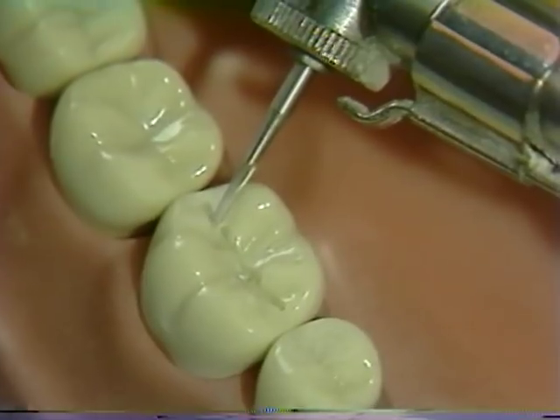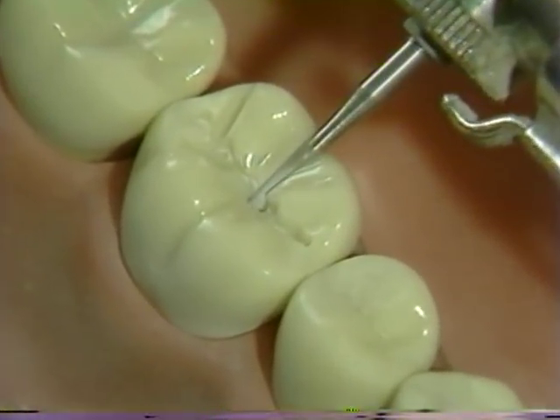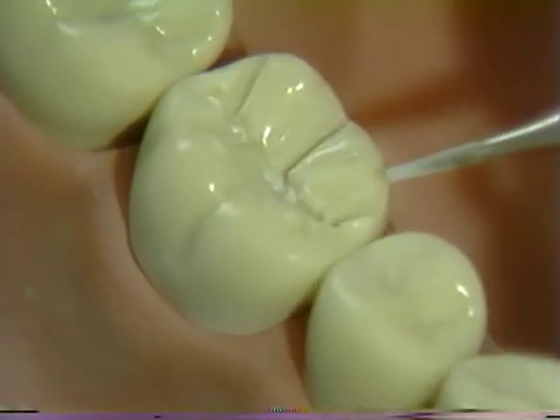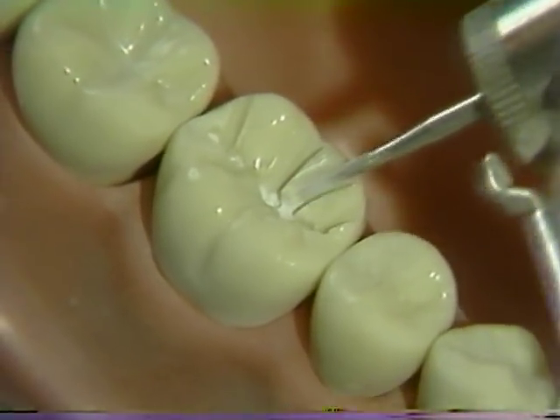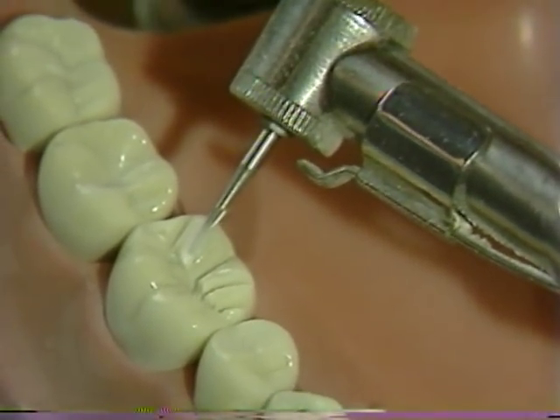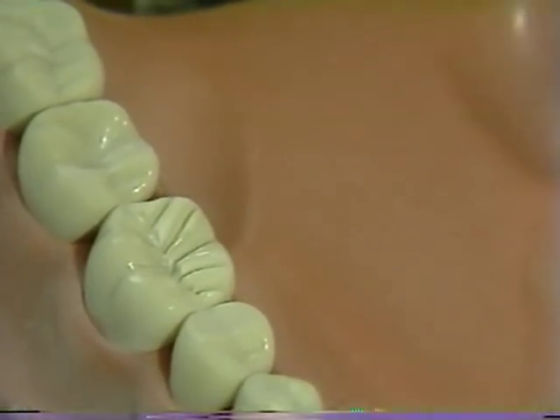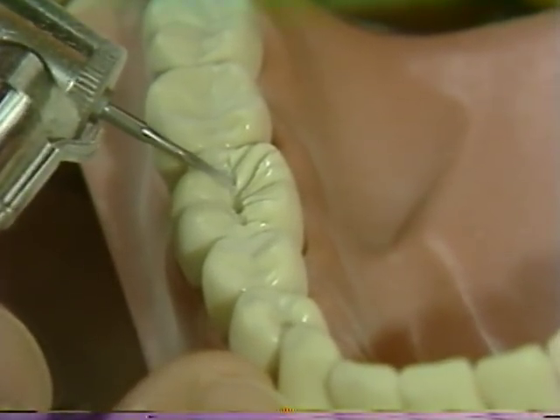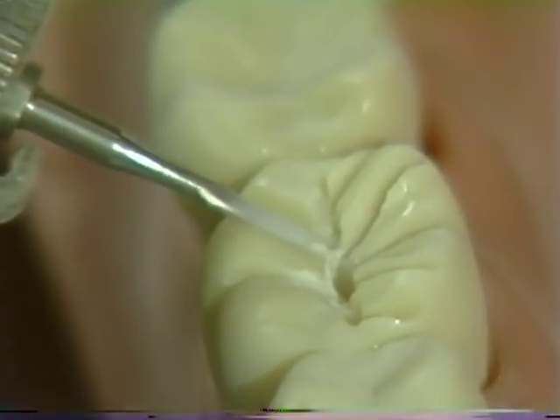The lingual depth grooves are placed next. At this time, it can be very helpful to be thoroughly familiar with the actual measurements of the rotary instrument. After the grooves have been placed in the respective fissures, place one depth cut at the crest of each of the two lingual triangular ridges. Once completed, these grooves should be approximately one millimeter in depth. The orientation of the carbide is then changed and the same type of depth grooves are placed on the lingual-facing inclines of the buccal functional cusp — recall that these grooves have to be slightly deeper, approximately a millimeter and a half.